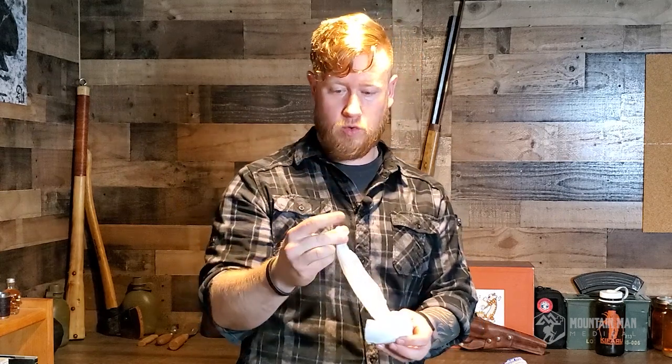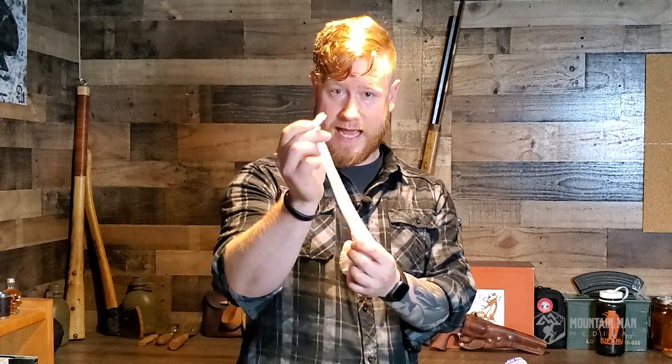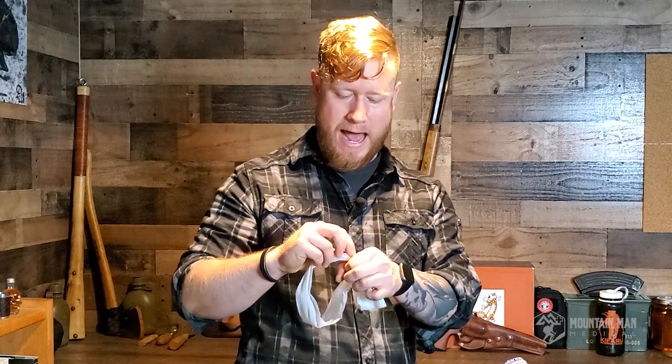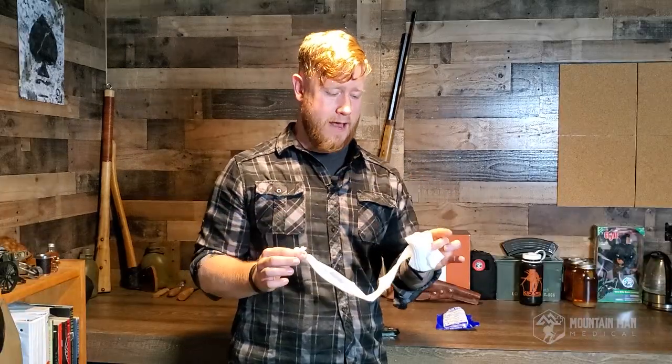You're just going to roll up a little ball just in your fingers. You can even tie it if you wanted to put a little tie in it. So now you've got this little ball at the end, and you're going to take that ball and pack it down right next to that artery. Then the rest of this you're going to have to hold. I can't tell you how many times I've lost control of this end and then all of the gauze just kind of lays out in this long tail, drags on the ground, picking up dirt and twigs — try to avoid that if at all possible.